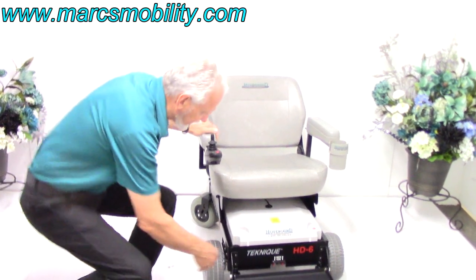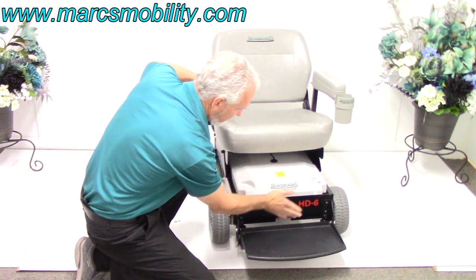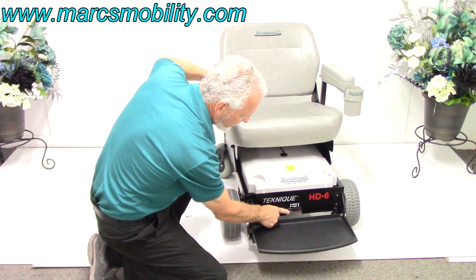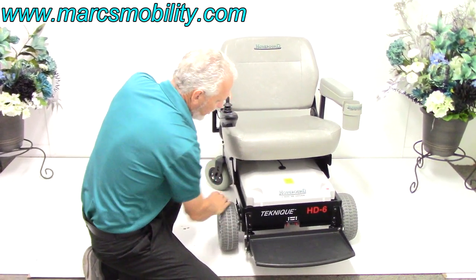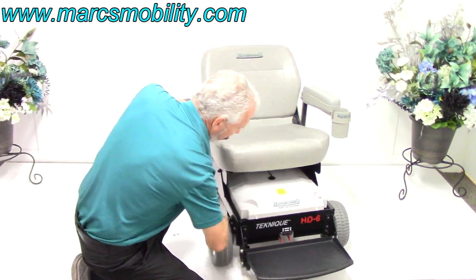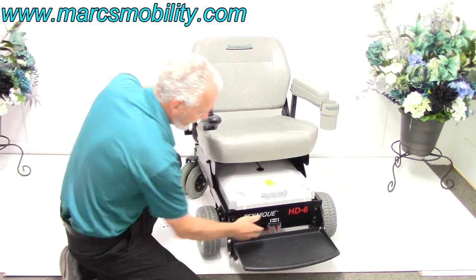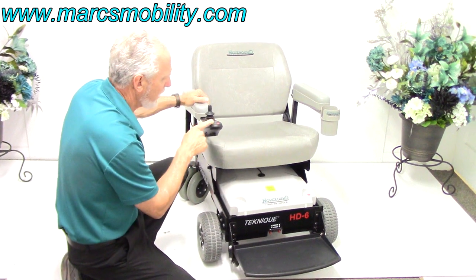This power chair has two HD motors, two heavy motors, one here and one here behind this cover. And right here are the levers to put the chair in neutral. So if you wanted to roll this chair right now, you can't, because the wheels are in gear. But if you push these levers down, on both wheels, you're in neutral. Back up, you're back in gear, turn the power on.